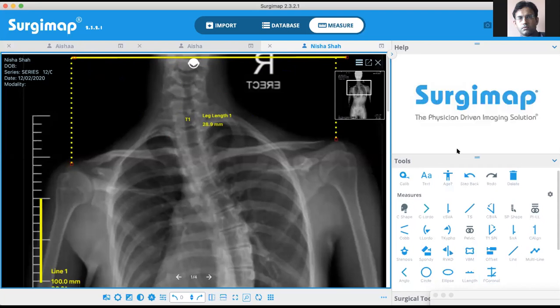So again, we are playing with some of these tools which are not meant to be actually what we are doing, but we are just utilizing them to our advantage. But I think, Amit, T1 tilt and clavicle angle are the two most important ones that you will measure. T1 tilt tells you the medial shoulder balance, and clavicle angle tells you the lateral shoulder balance. So the trapezial prominence is the T1 tilt, and the level of the acromion is the clavicle angle. There are so many measurements in this, but practically this much is enough for you to make a clinical judgment.